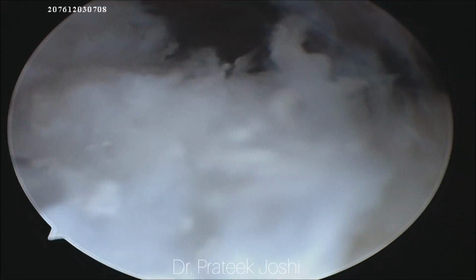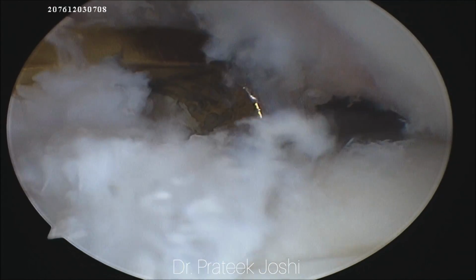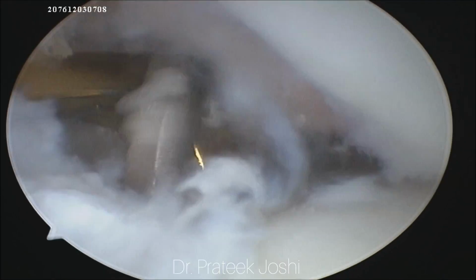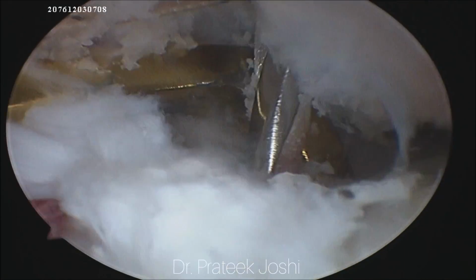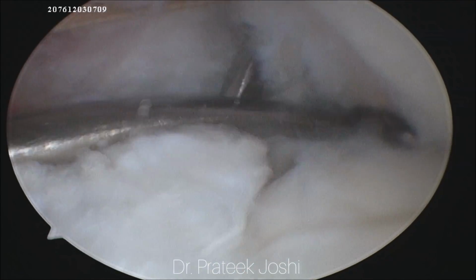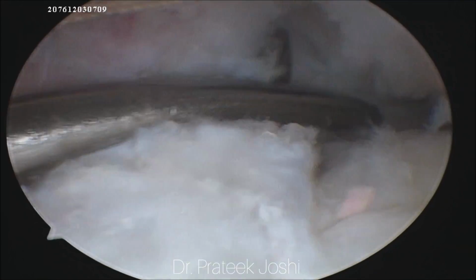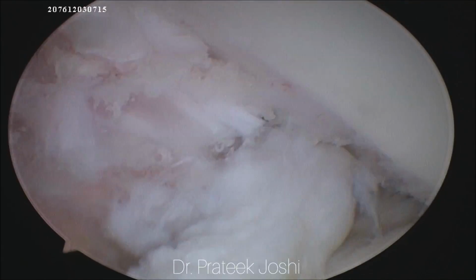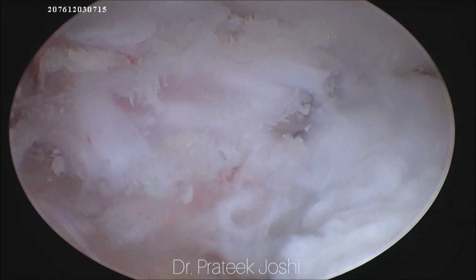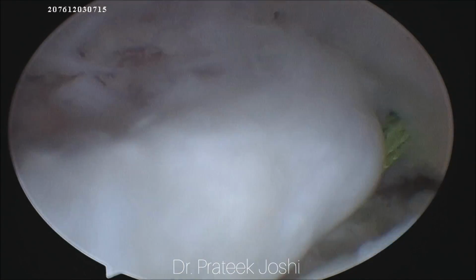So I am going to keep the tip of the ACL jig in such a way that the guide wire comes just posterior and medial to the anterior horn of the lateral meniscus. And since it's a 10 millimeter tunnel, I am going to keep it slightly posterior so that there is no anterior blowout of the tunnel in the end. So I am sequentially drilling with 7 millimeter and then with 10 millimeter drill bit over the guide wire, because the diameter of our graft at the tibial end is 10 millimeter.